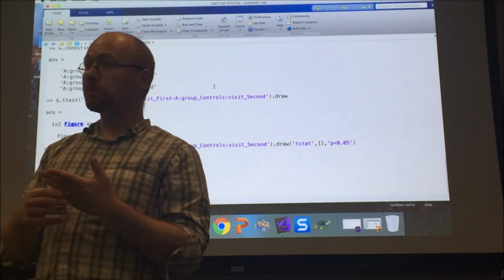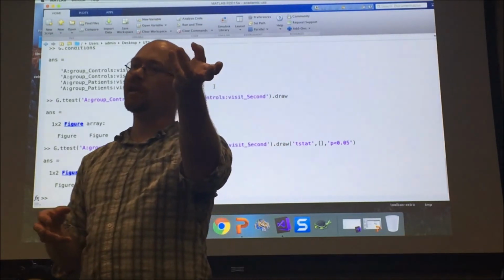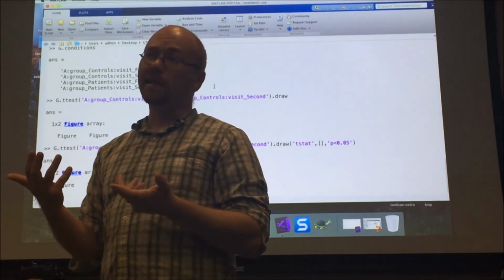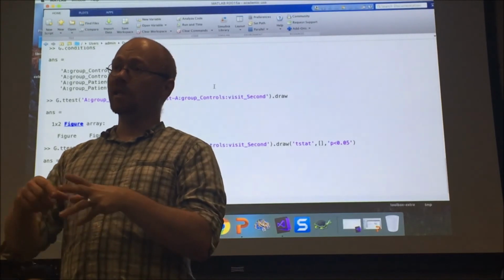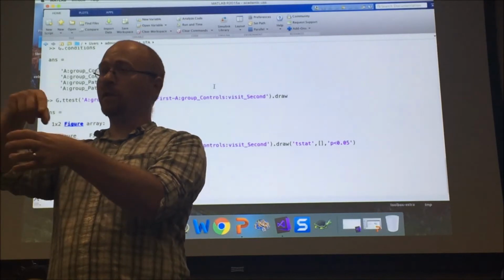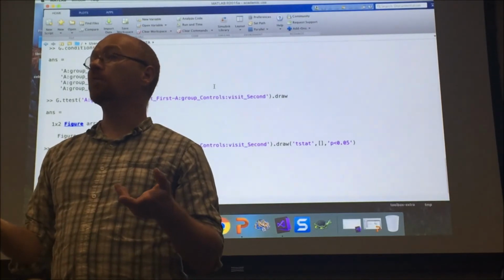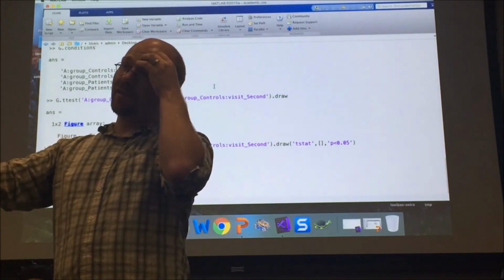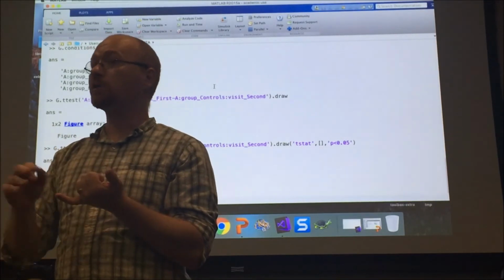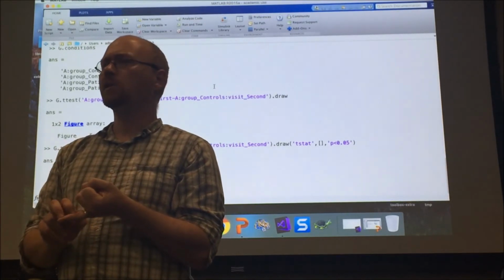You can do region of interest based analysis. If you were worried that maybe it's channel 1 on my head, but if Jonathan's got a smaller head than me it's maybe channels 1 and 2, the way that we might conventionally deal with this in the NIRS field is a region of interest average. We take the channels on the left side, average them, and then pool the region of interest averages at the group level. There are different ways to go depending on, A, what data you have available, structural MRI or not, or how well you've registered the probe, and B, what kind of assumptions you're willing to make.